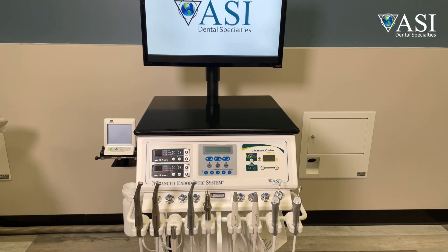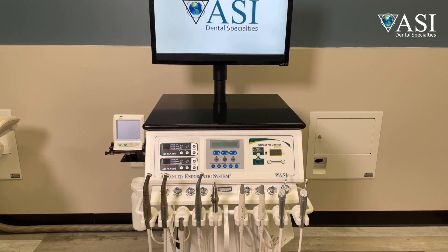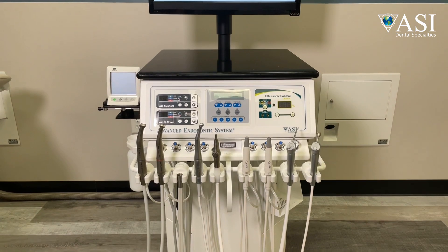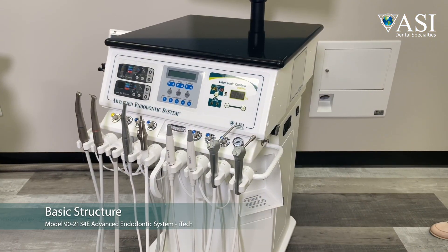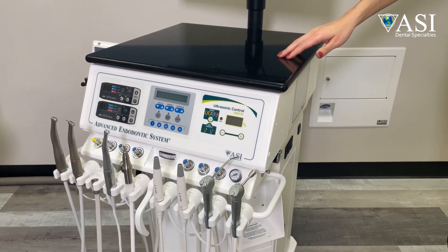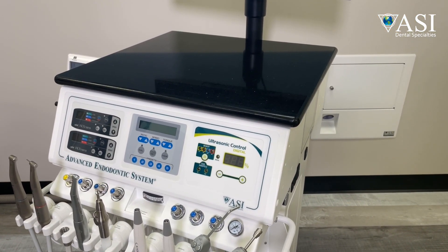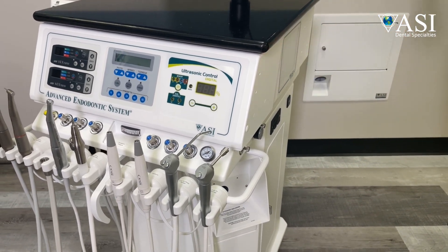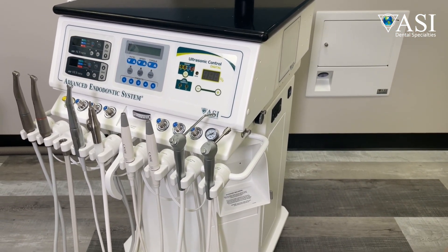Not only do we integrate instruments, but everything that typically goes on counters or inside cabinets can be done on the cart. The basic structure overview includes a large, non-porous engineered quartz worktop called Cambria and a custom paint color. The main chassis is a 1/8th inch thick wall aluminum with a durable powder coat finish.